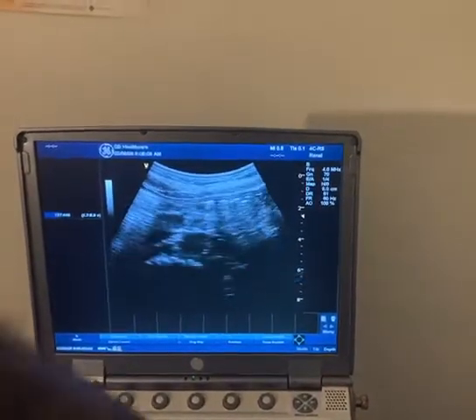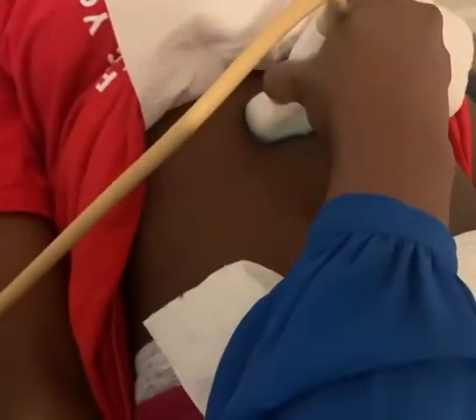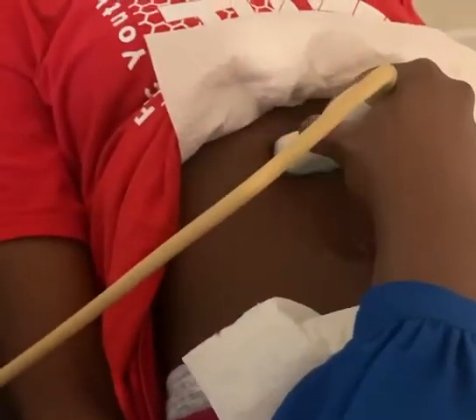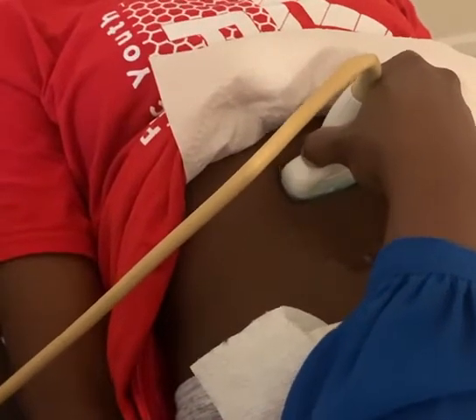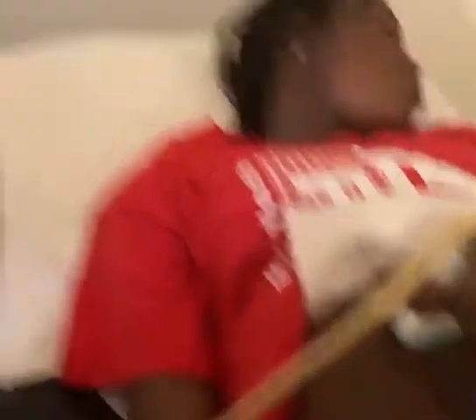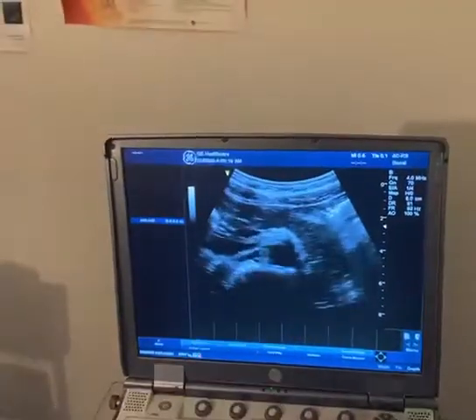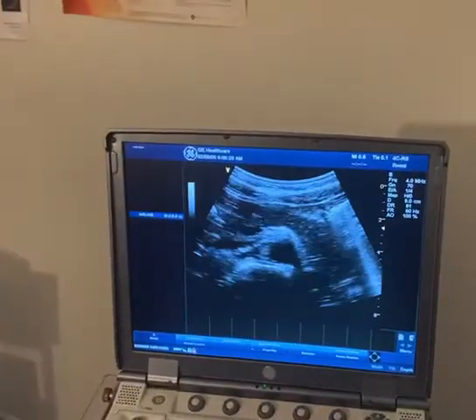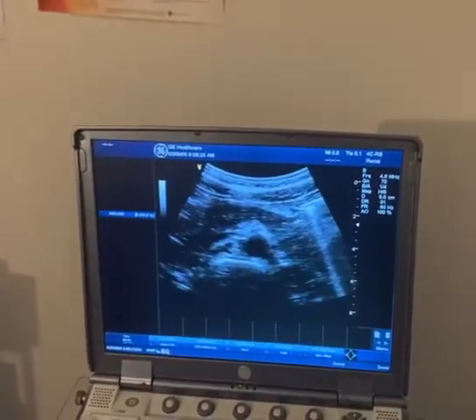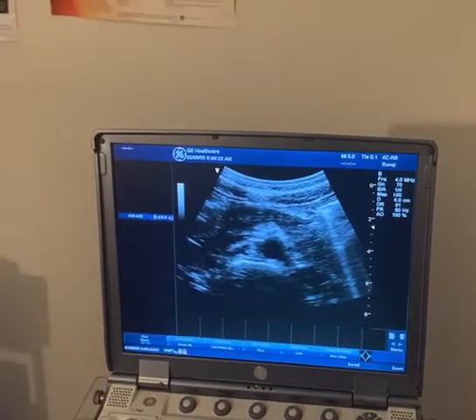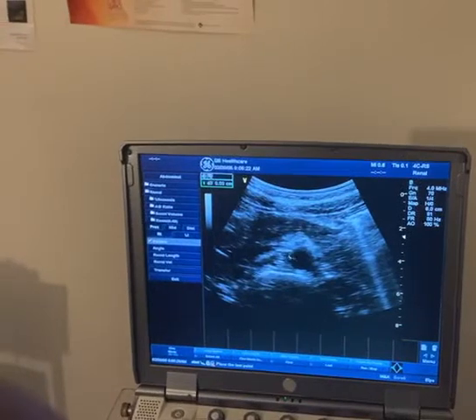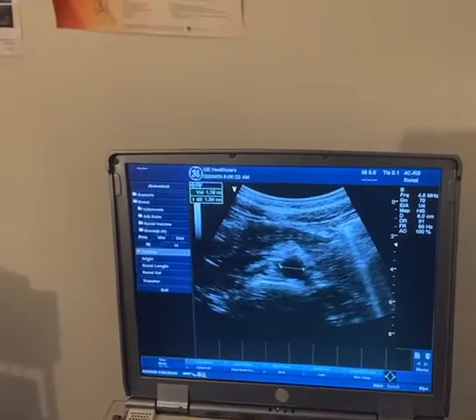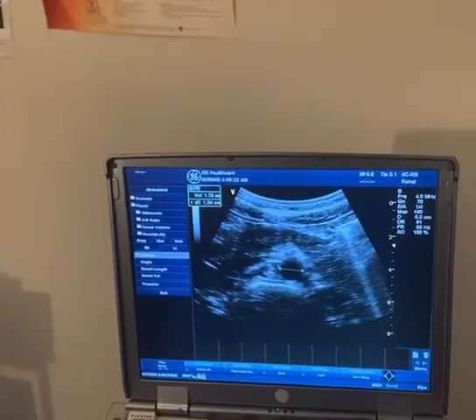Now I'm going to go back to the proximal abdomen. I'm right at the proximal abdomen again. When you measure your aorta, you have to measure outer to outer. Looking at my screen, I'm at a transverse segment of the aorta. I'm going to freeze that image and measure the proximal segment. You're measuring from the outer to the outer — that's the proximal aorta in a transverse image.